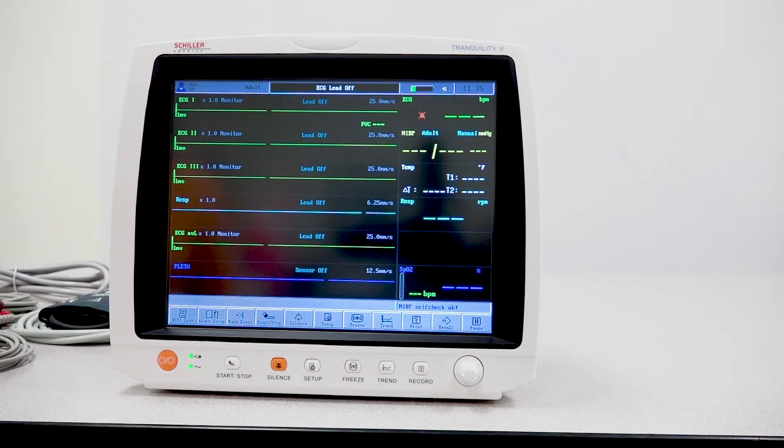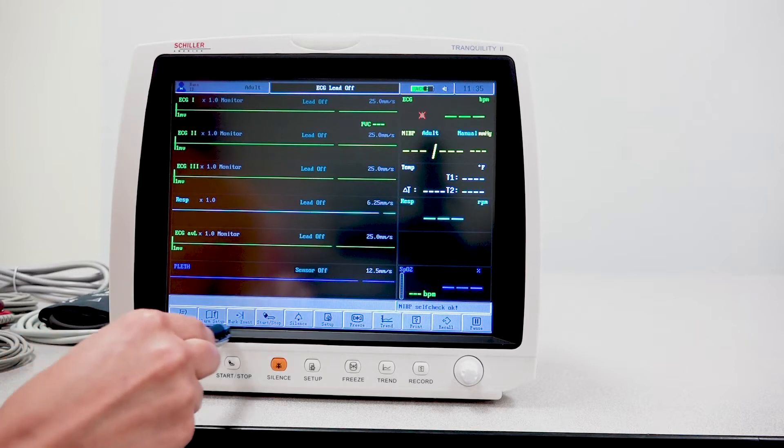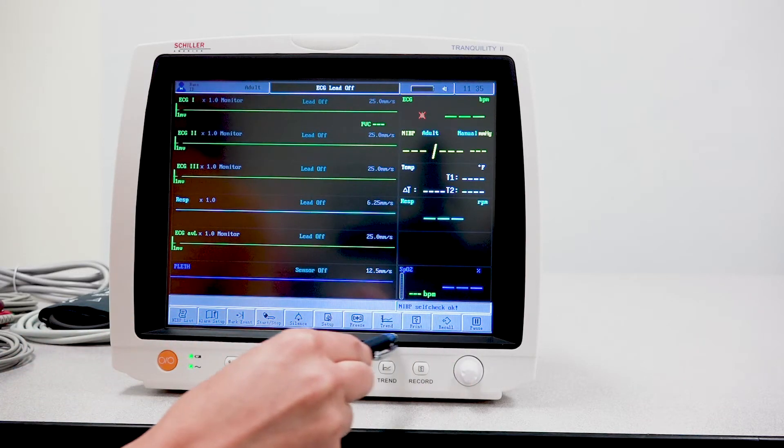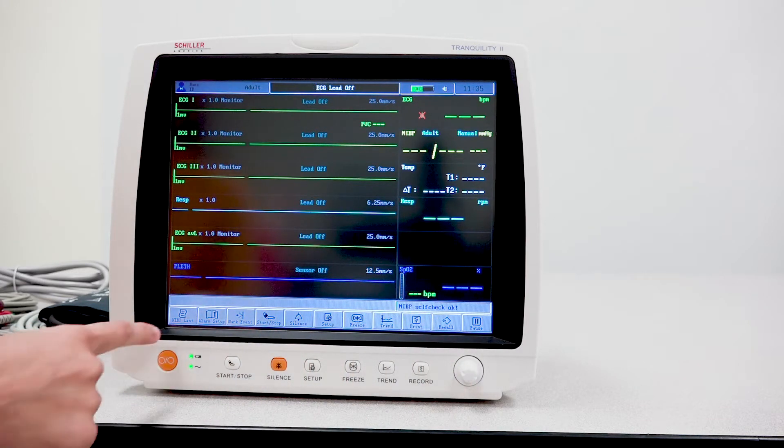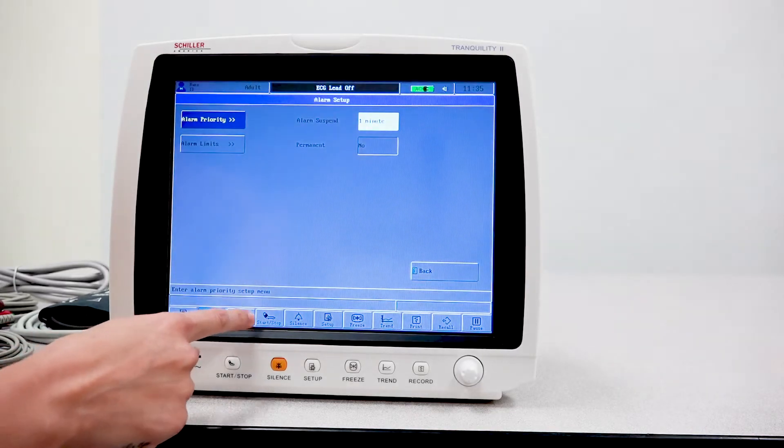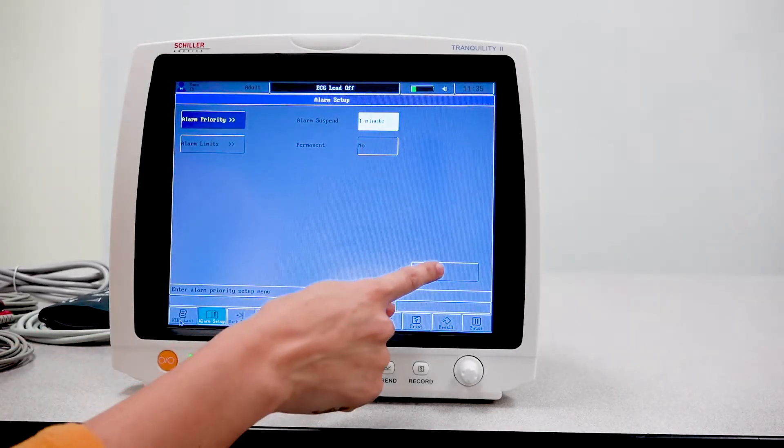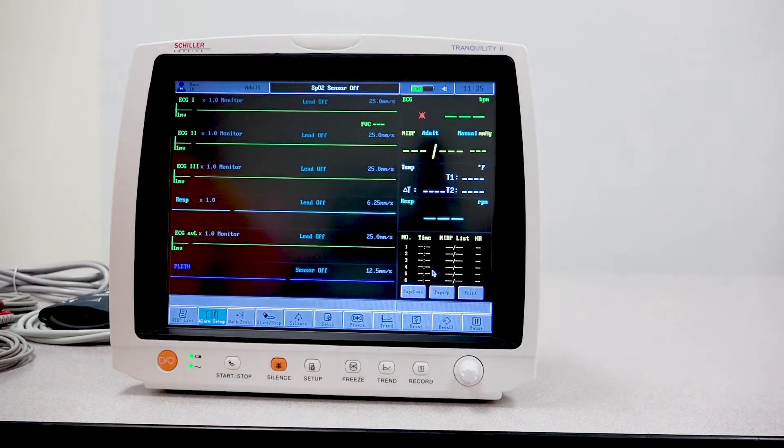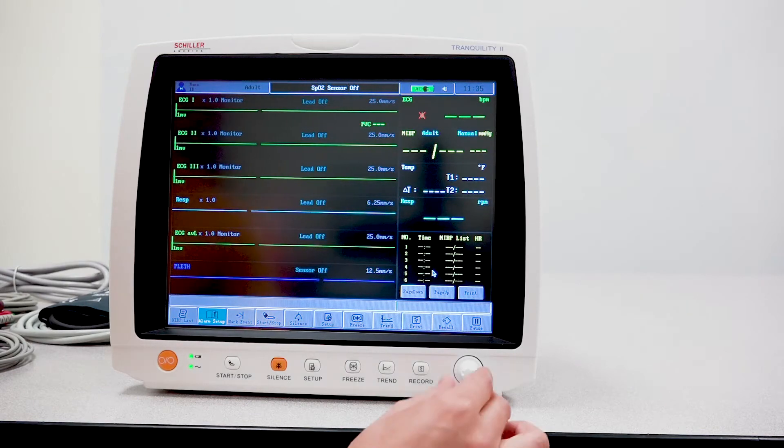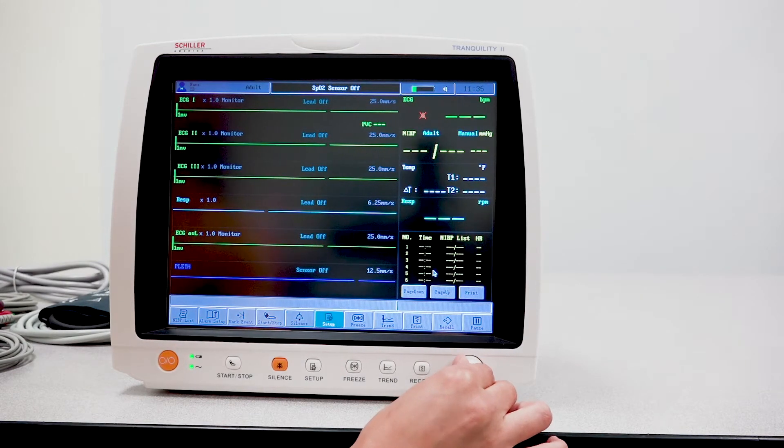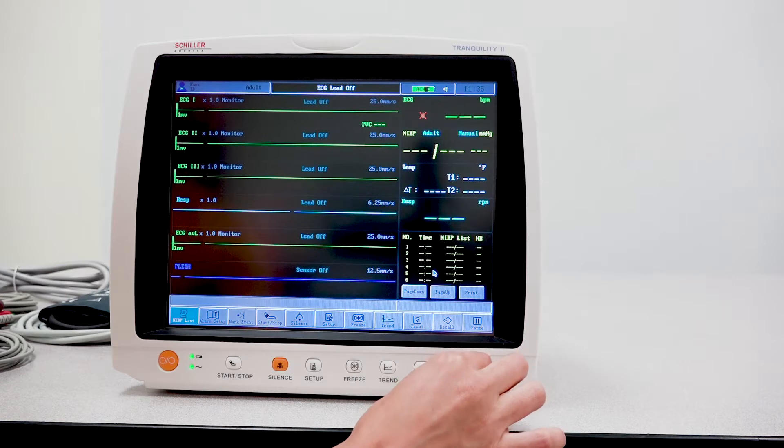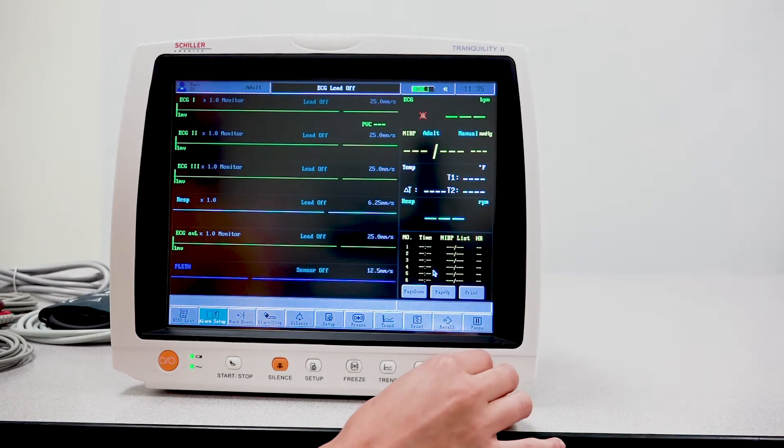If you notice, you have quite a few options here at the very bottom. This unit is touch screen, so you can select or navigate through by touching, or by using this knob you can also navigate through the different tabs.